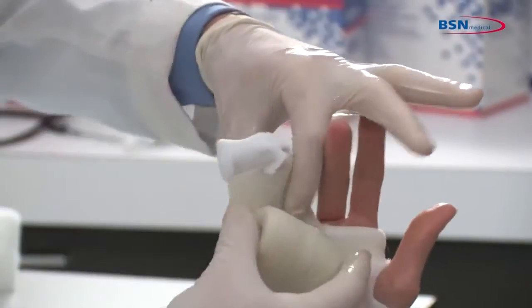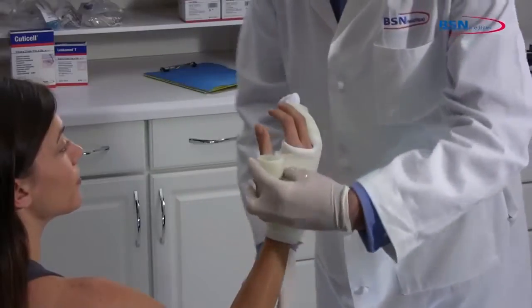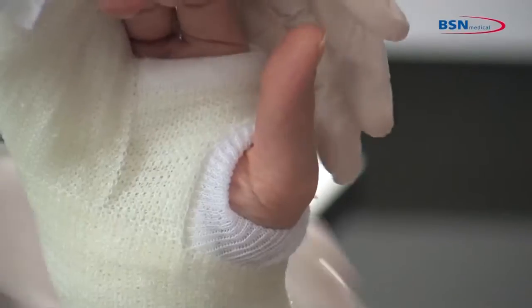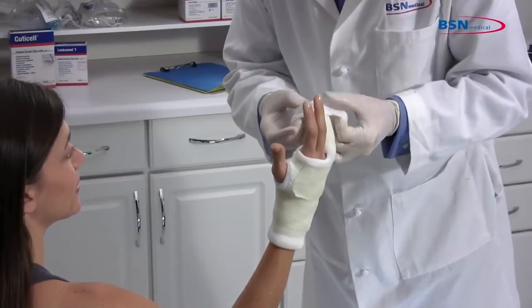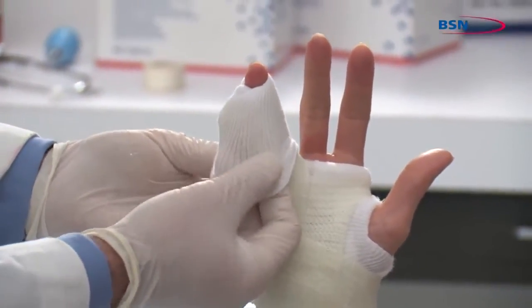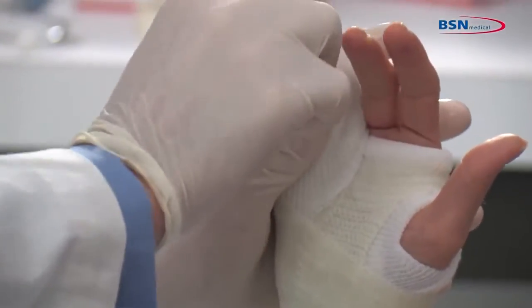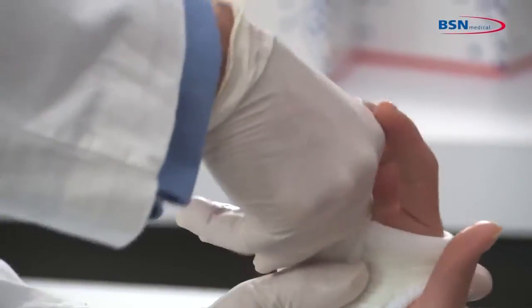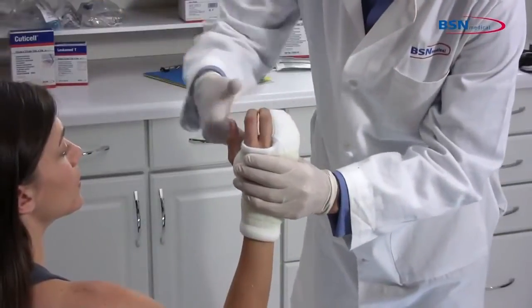Be sure to leave approximately one-half inch of stockinette exposed to leave a soft end. Fold back the stockinette over the fourth and fifth phalange to lessen irritation on the third phalange. Make sure that the distal ends of the fourth and fifth phalanges are accessible to check on circulation. Now position the fourth and fifth phalange.